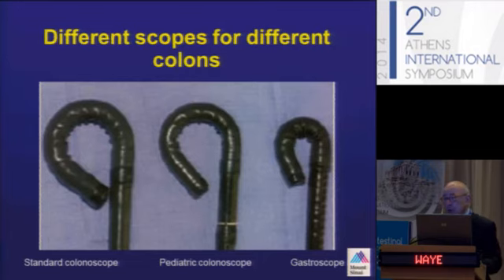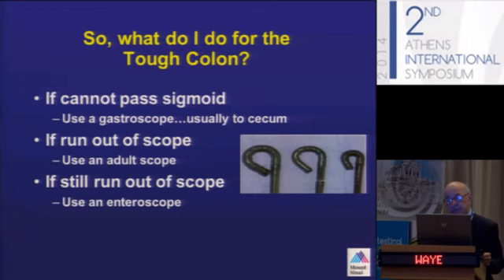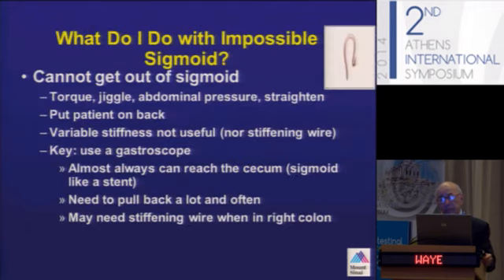So there's different scopes for different colons, and the standard colonoscope is one that everybody uses. The pediatric colonoscope is my favorite colonoscope for general colonoscopy, and if I really have a difficulty in the left colon, I'll use a gastroscope. So I think that you have to tailor the instrument for the procedure. If you can't pass the sigmoid, use a gastroscope, and it usually gets to the cecum. If you run out of scope, use an adult scope, one of these that are more sturdy. And if you still run out of scope, use an enteroscope. So I think that there's different instruments that you have to use when you get in trouble with various types of procedures that you're going to do.